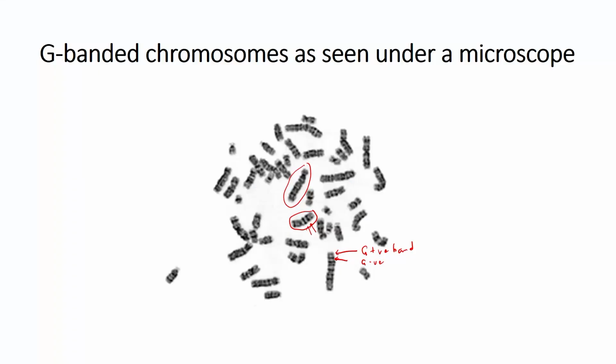So the chromosome architecture alternates: less thick, more thick, less thick, more thick, like this. By removing the outer protein layer or superficial layer, one is now seeing the chromosome architecture. And this is permanent. It will not change with time or with different developmental stages.